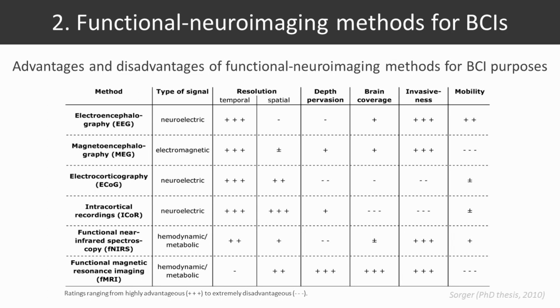So I will not go through all these evaluations. You might have a closer look later, but the take-home message from this table is that every method has actually its pros and cons, and there's no perfect BCI method. One always has to consider the particular purpose of the BCI and choose the best suited method.